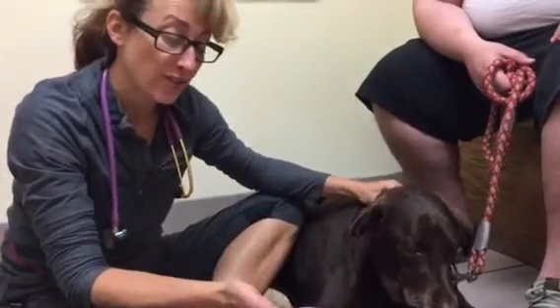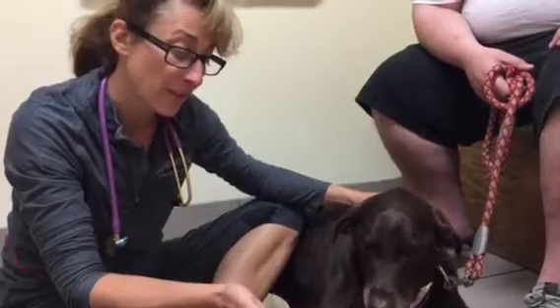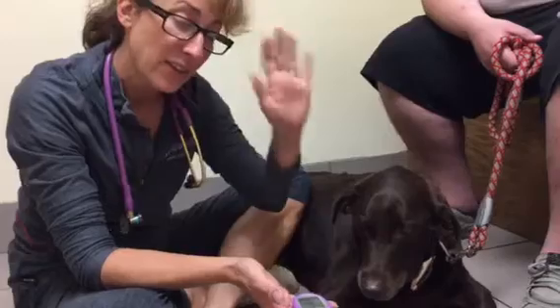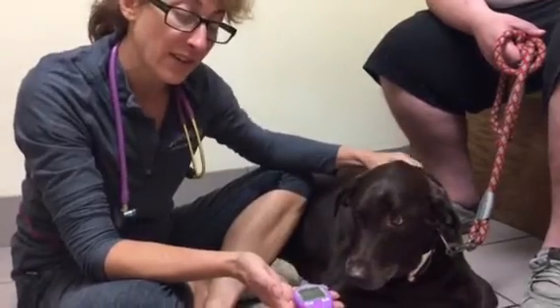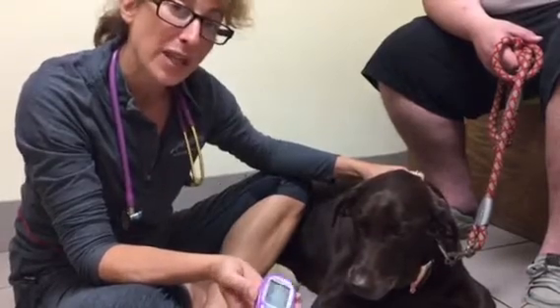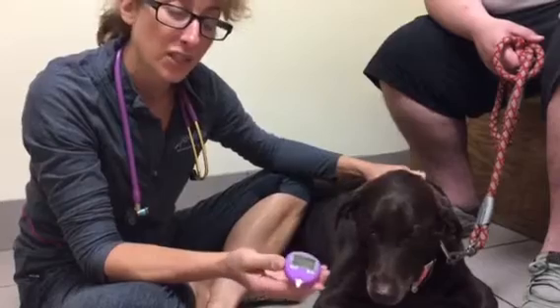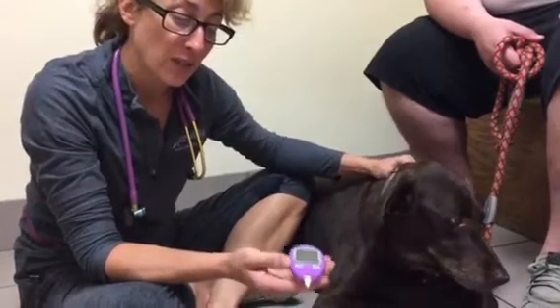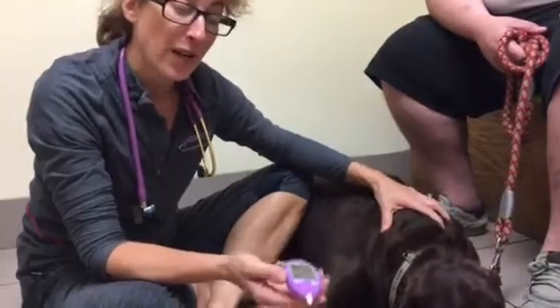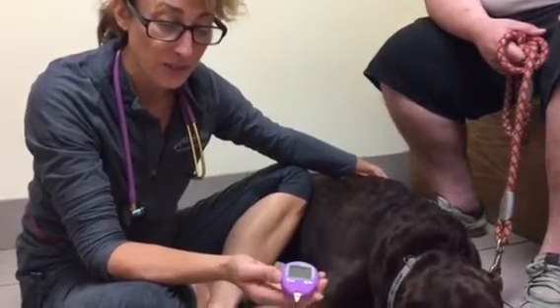She needs some insulin. Talk to your vet about what insulin is appropriate and affordable — two very important things. Talk to your vet about which kind of glucometer is best as well. There are lots of options on the market, but unfortunately a lot of them have a really cheap glucometer and then the test strips become really expensive. You've got to make a good, wise investment going into it. Buy one that's vet-appropriate, buy one that you can get the strips for, and buy one that has affordable strips — because there's no use spending a lot of money on a glucometer if you can't afford the test strips.